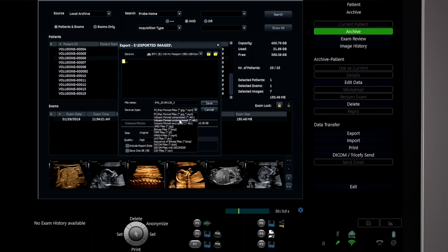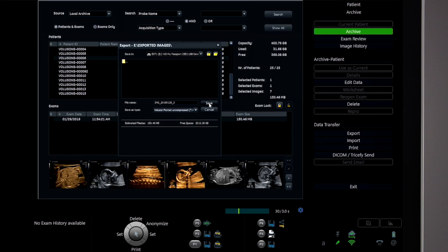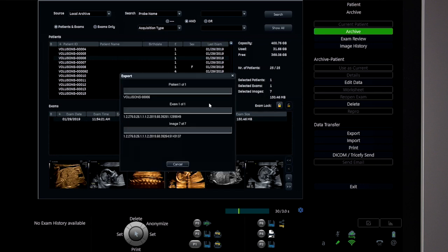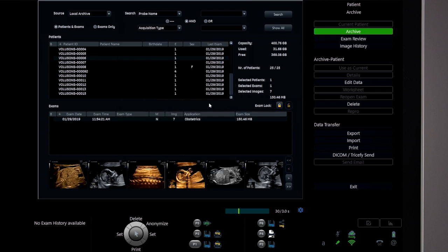These formats allow the exported studies to later be imported back onto the Voluson or into 4D View. Voluson format uncompressed will export a folder with images and data inside. Voluson format compressed will compress this folder into a single file; however, the compression takes slightly longer than exporting uncompressed. Exported 4DV files from the patient archive cannot be anonymized.